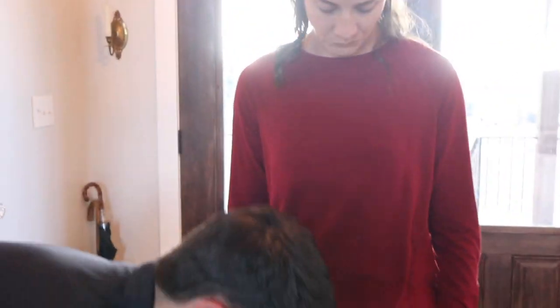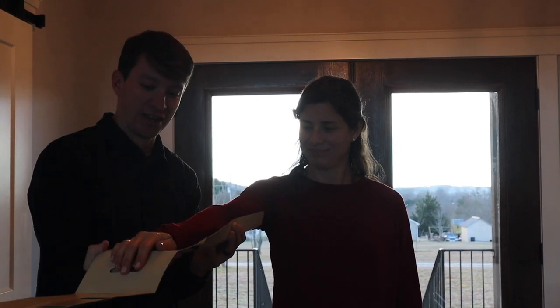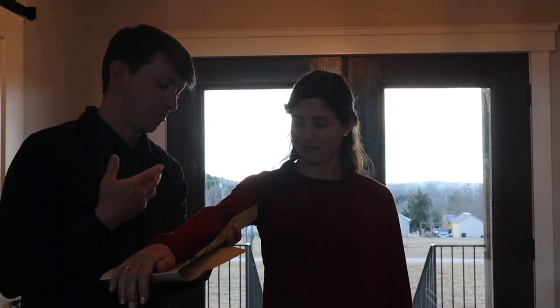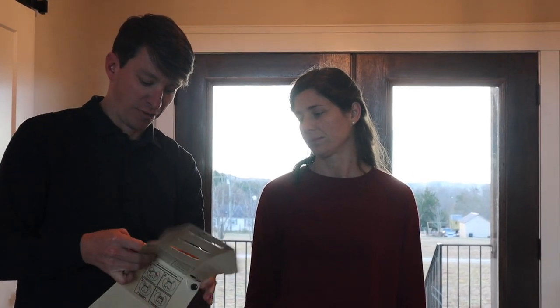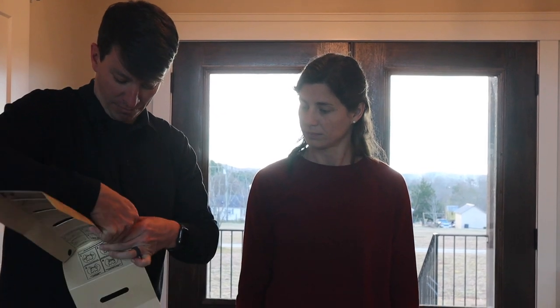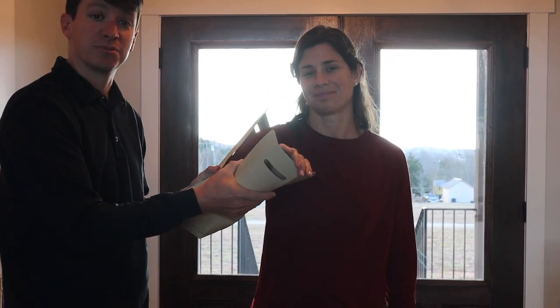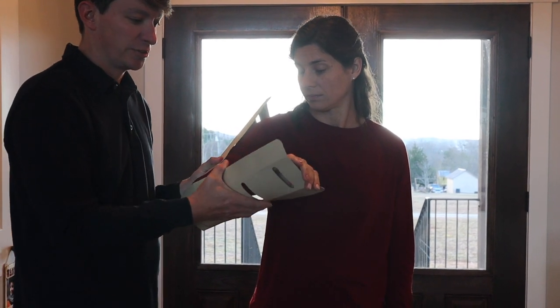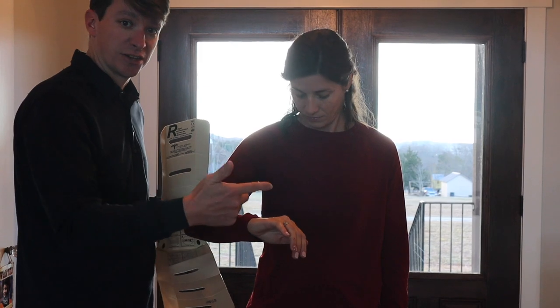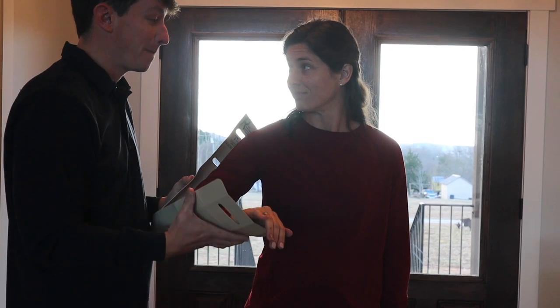Let's say she has a fractured arm right here and she's not able to move it. You can take the splint, fold it, and then just use tape or a pressure bandage to wrap it and secure it. Since we have the ability to do a 90-degree angle, we can also splint the upper arm. Using a pressure bandage, tape, co-band, or whatever you want to secure it — just make sure that when you're done wrapping, you check for pulse, motor, and sensory. Check for a radial pulse: can you move your fingers? Can you feel me touching? Perfect.